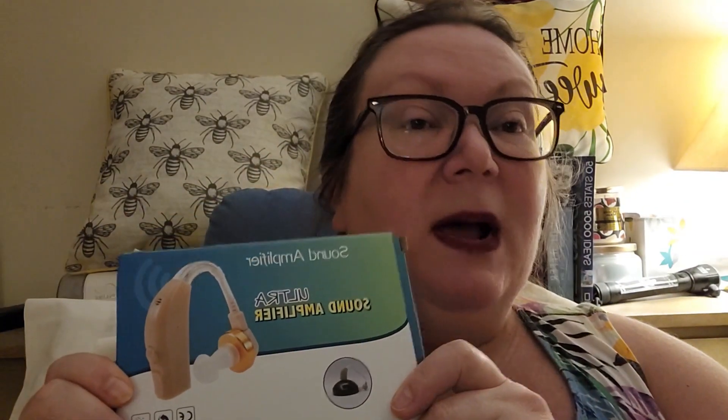At Temu, I found this sound amplifier — they have different varieties — and it had a lot of really good reviews from other people like me that needed a hearing aid but couldn't afford one. Because it's like $3,000 for a hearing aid, and not many people have that kind of money laying around. So I thought, let me just look and see if Temu has any hearing aid type things, and I found this.